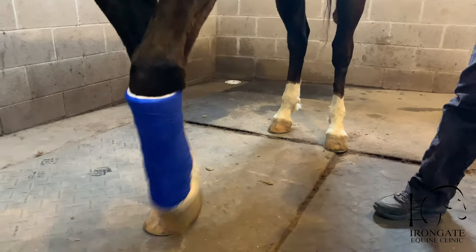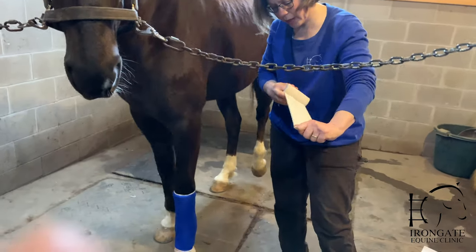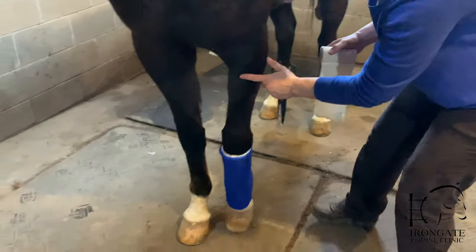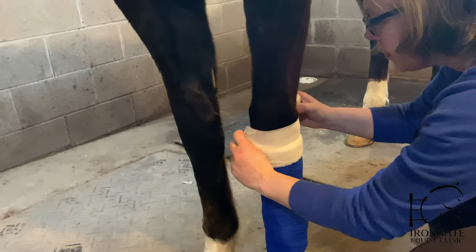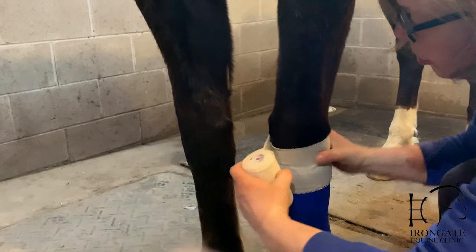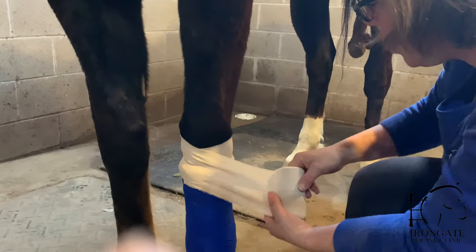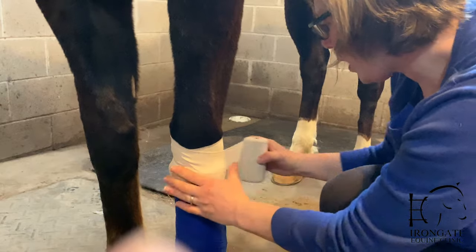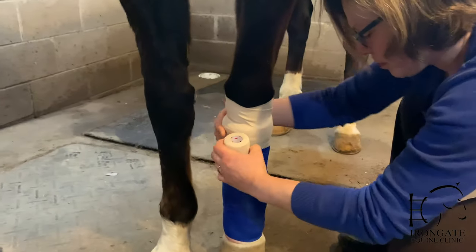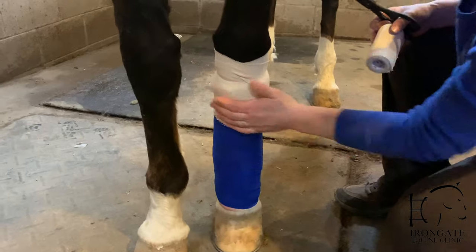The last thing we'll do — you'll want to take your gloves off at this point — is put some adhesive tape. This has stretch to it as well as a sticky back. We'll put a wrap around the top to adhere the bandage to the hair and keep it from slipping, as well as to keep dirt from getting in the bandage. You want to pull it off the roll and then let it relax and lay it on the leg so that you don't get it too tight. That'll seal the top.